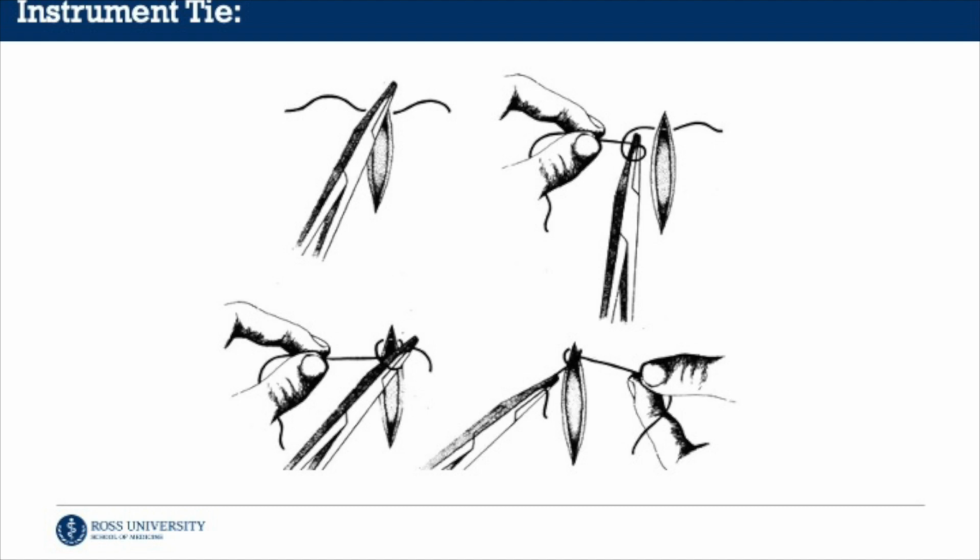To add security to the knot, you can continue the last step of the surgeon's knot with a single loop around the needle driver and alternate back and forth with the directions of your hands to lay the knots down. This time, however, every single knot counts as one security knot as opposed to the first 2 that were required to complete the surgeon's knot.